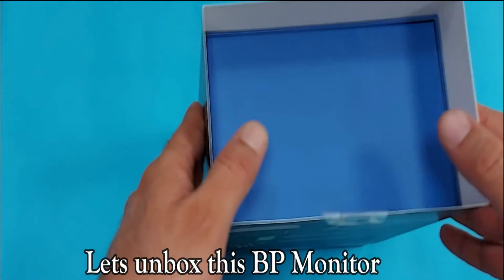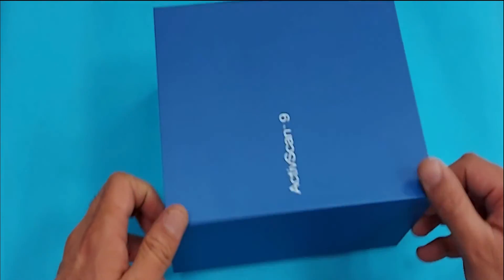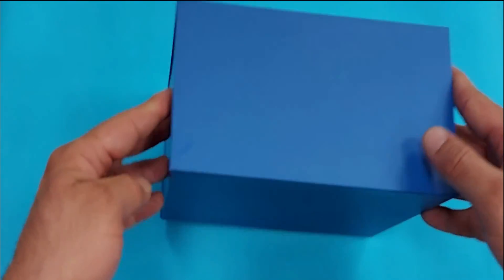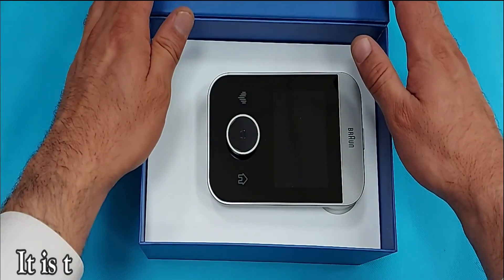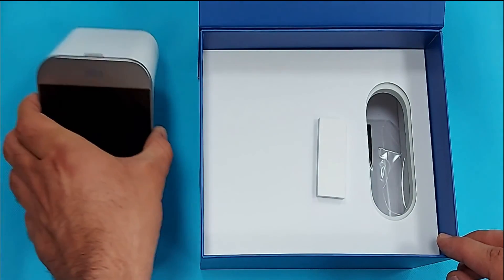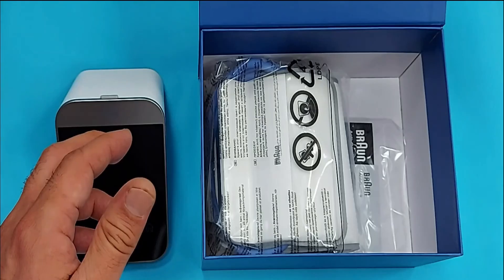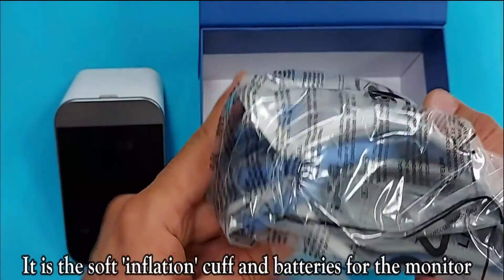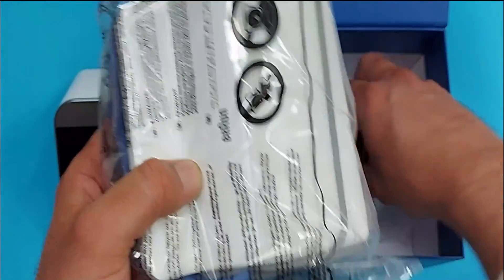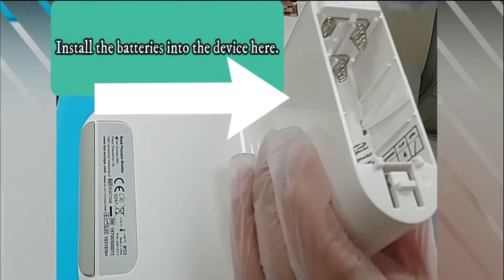Let's unbox this BP monitor. Open the box from here. It is the Brown AKSK9 BP monitor. It comes with the inflation cuff and batteries for the monitor, as well as a booklet and a quick guide for setting this BP monitor. Install the batteries here.